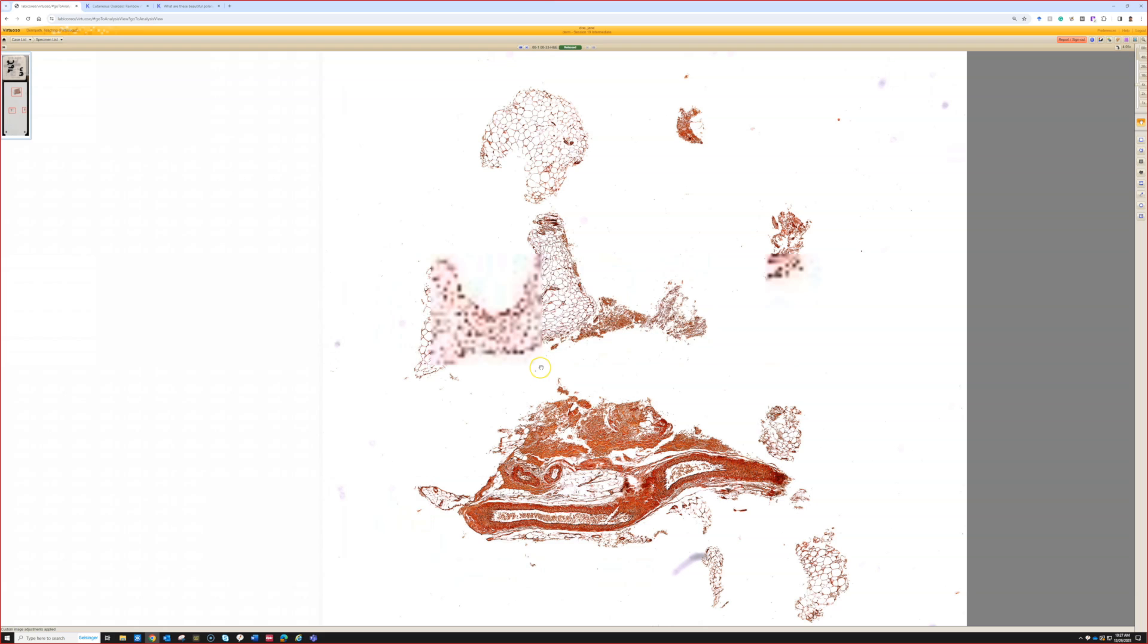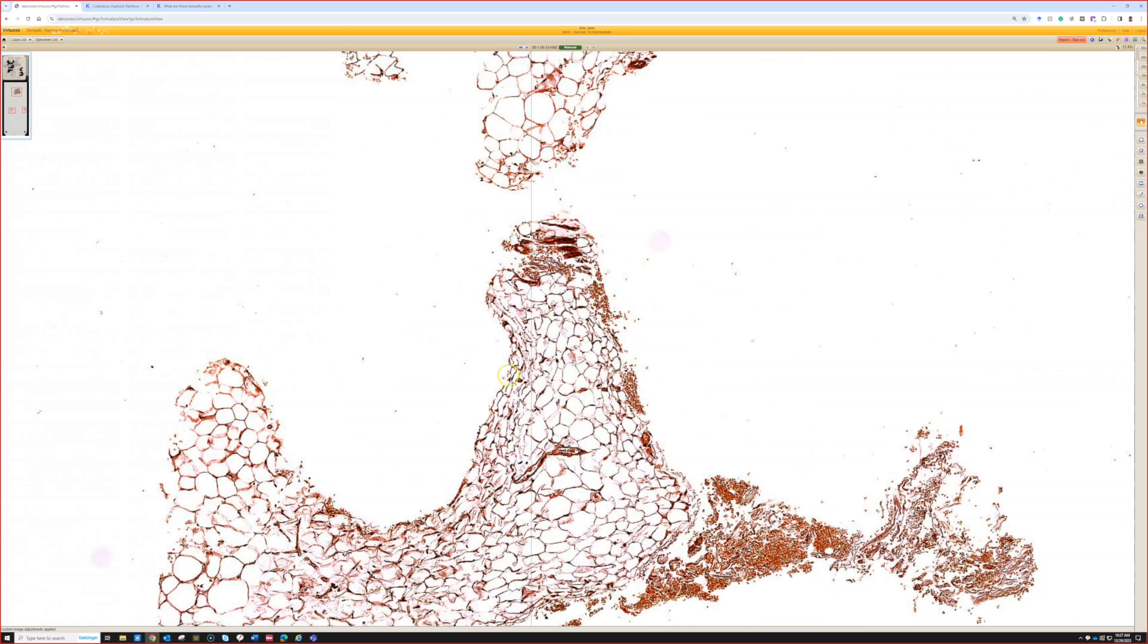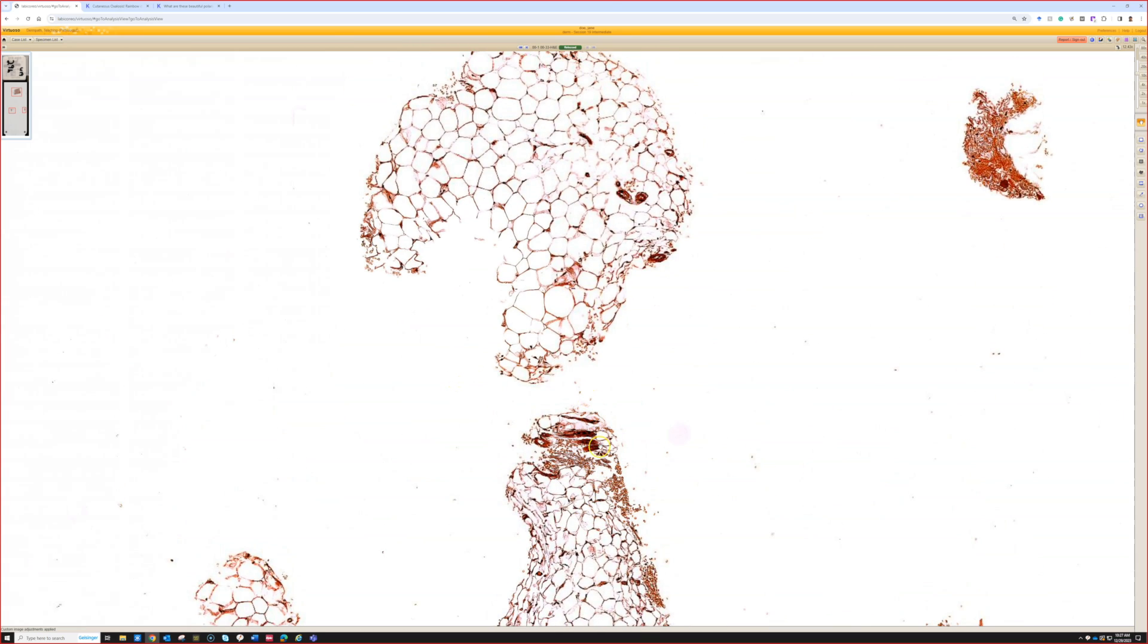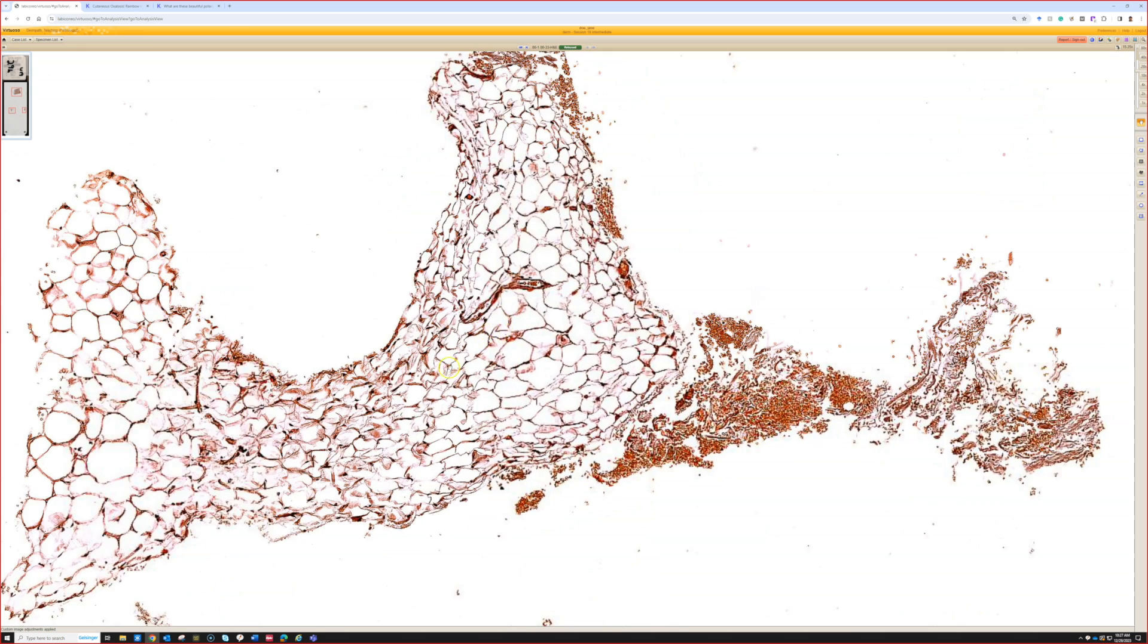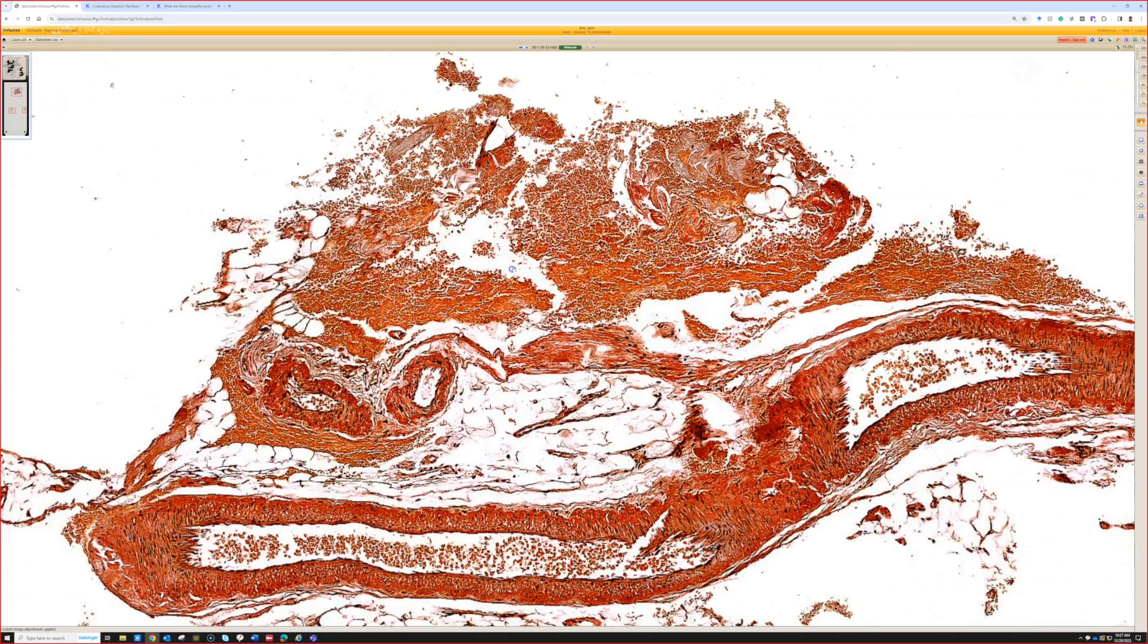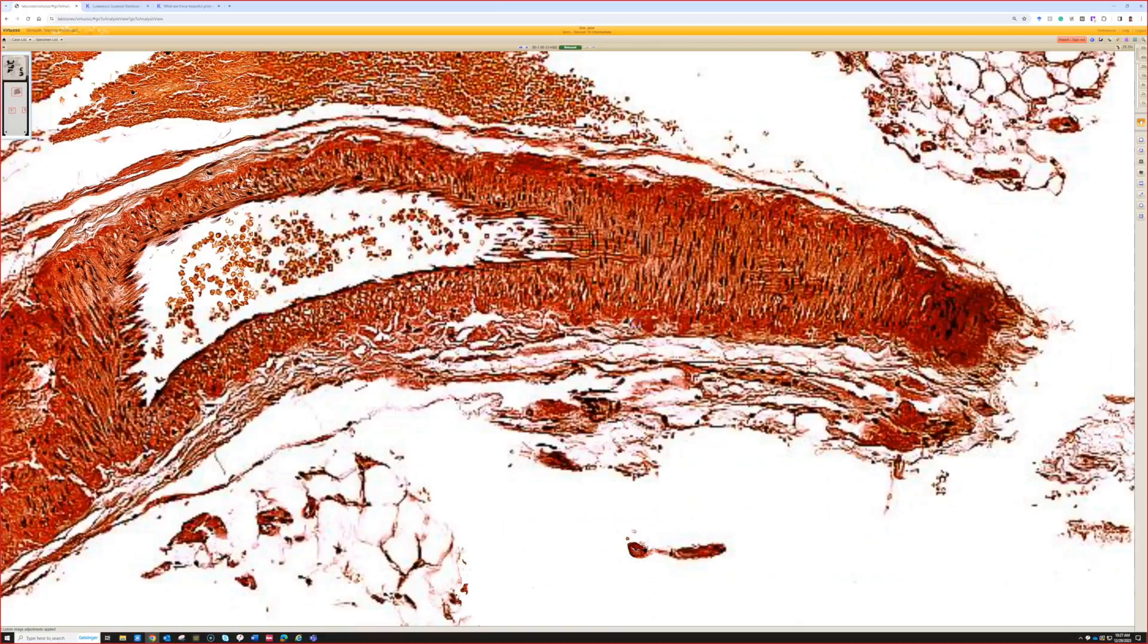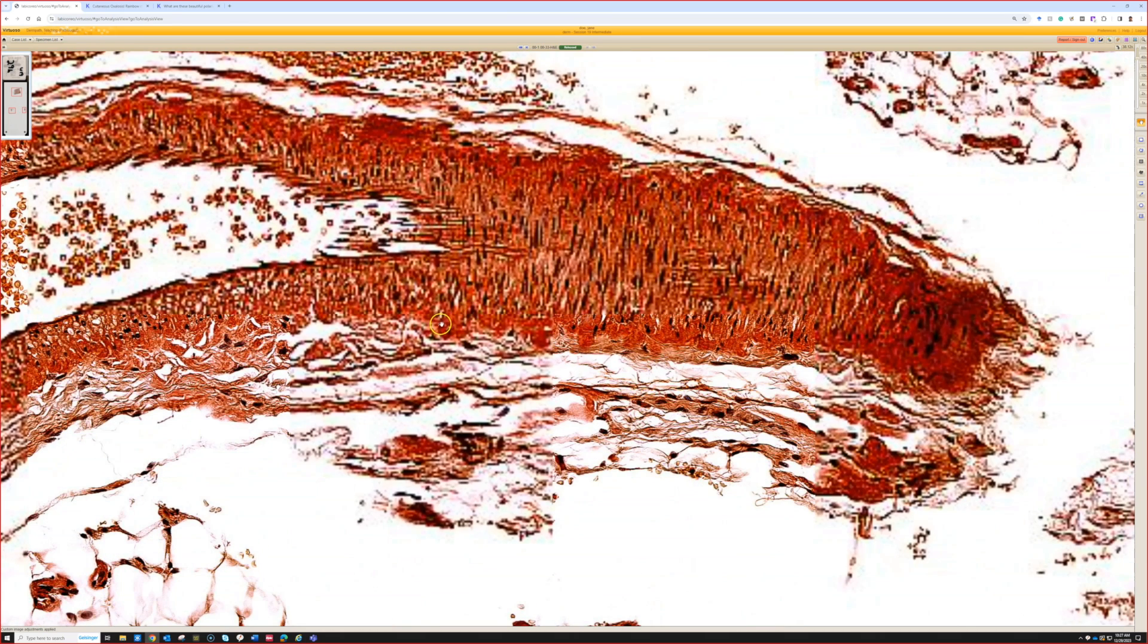Normal collagen will have kind of a yellowy green birefringence automatically to it, and so it can make it really hard in my opinion to tell real amyloid apart from background collagen. That's why I've really found the thioflavin T to be better in my experience. Here we can see the deposits in the vessel wall.